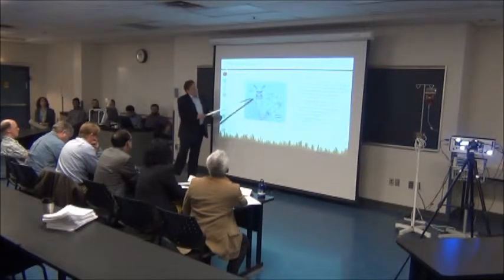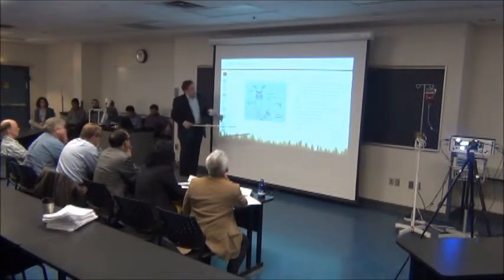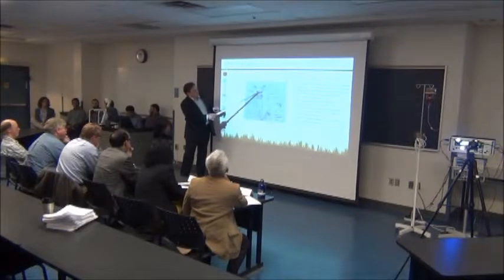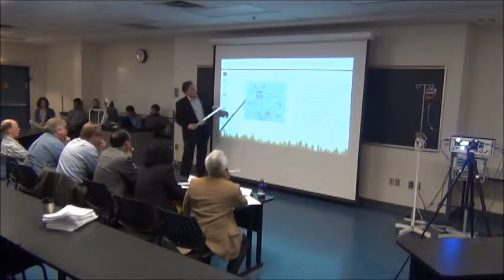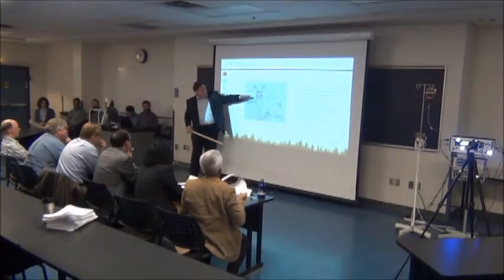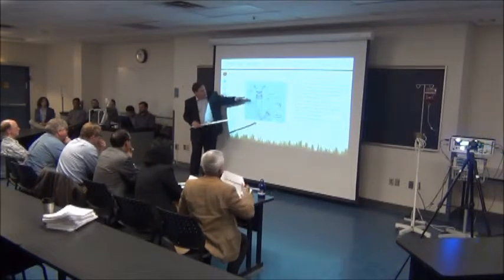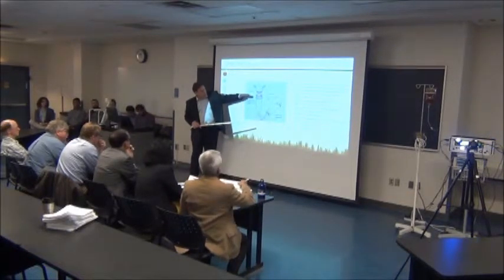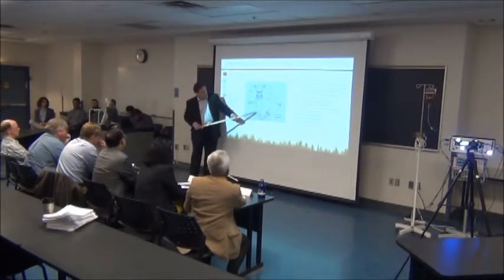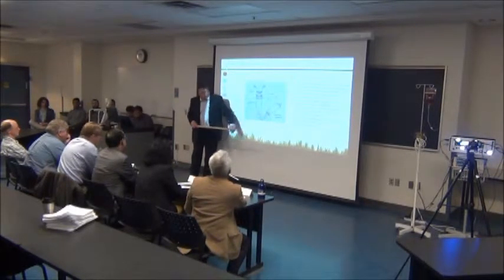So this is showing the transducer undone. So basically, this is the pressure dome. There's the diaphragm, and this entire piece here would be filled with saline. You have the pressure wave running in, and then the diaphragm would be responding to it, much like a microphone. And as the diaphragm is moving in and out, it's producing a micro voltage going up and down out here.